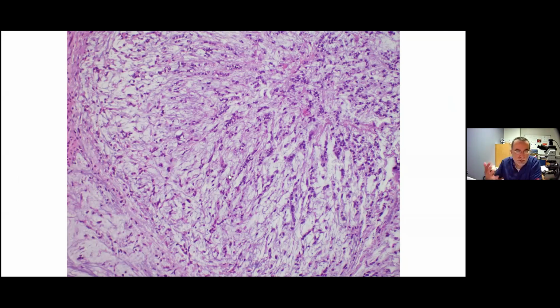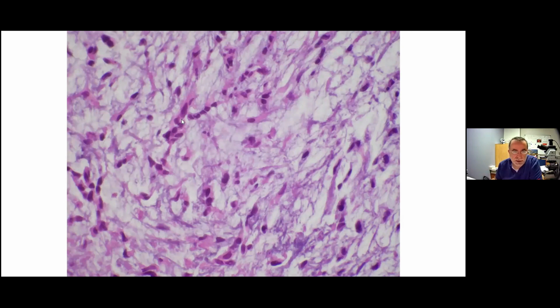So it brings into the differential diagnosis other entities, although the location is very atypical, like chordoid glioma and chordomas and stuff like that. But the imaging and the location argue against it. On closer look, there are no high-grade features, no necrosis, no vascular proliferation, no mitosis, and the atypia and the pleomorphism are still reasonable. And here you can appreciate the presence of this vacuolated background, which is myxoid material. So we have tumor cells that are arranged in cords and embedded within a predominantly myxoid matrix.